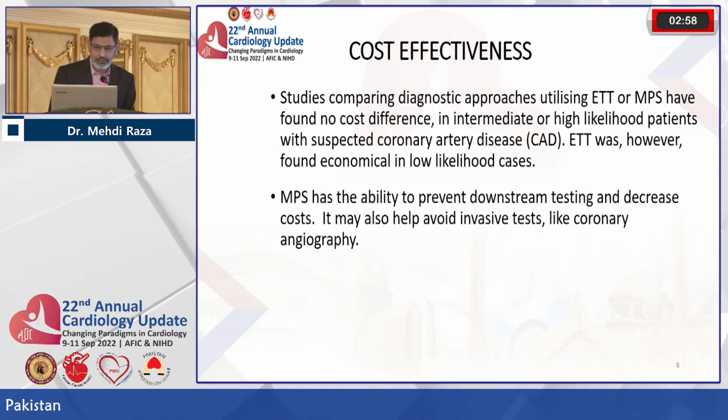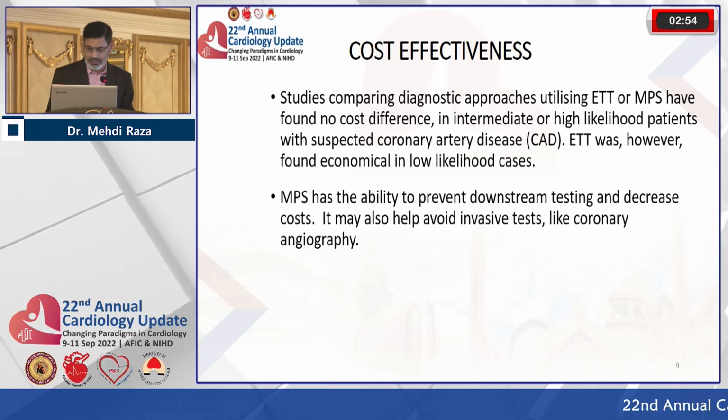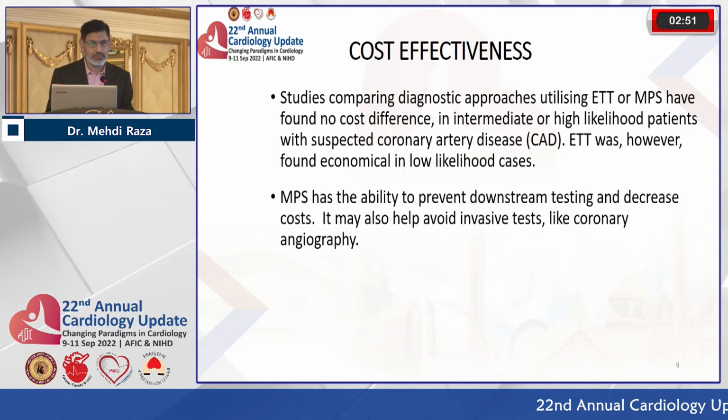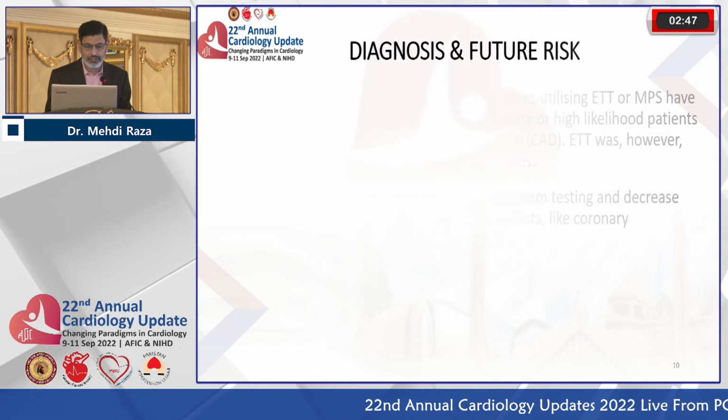There are studies which document that myocardial perfusion imaging has the ability to prevent downstream testing and decrease costs, and it may also avoid invasive tests like coronary angiography.